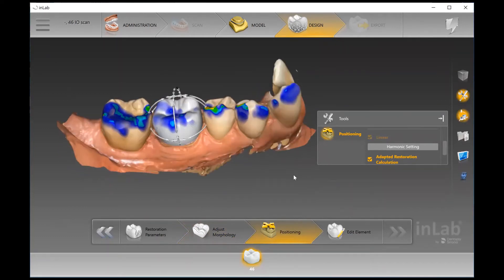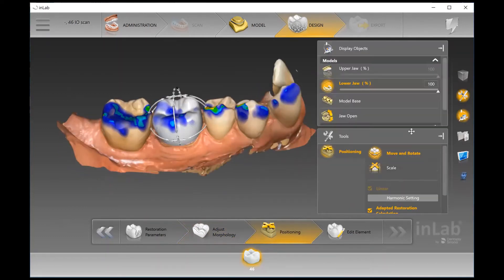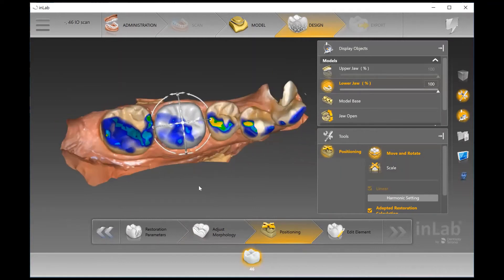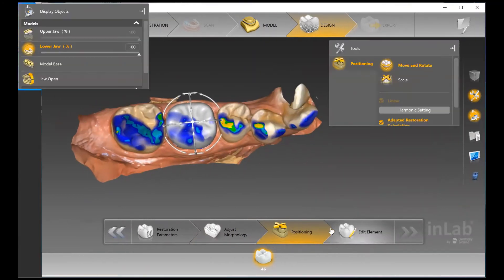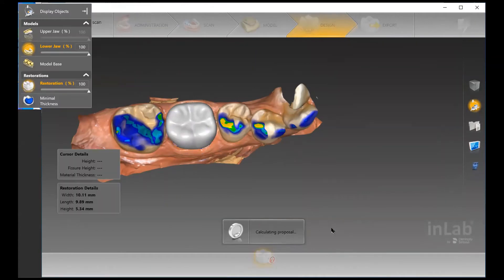For the Positioning step, for a single crown there's not much you have to do, but you can move, rotate, and scale certain things prior to the software giving an initial design. That's maybe more relevant for complex bridge work where you want to specify some positioning prior to designing.